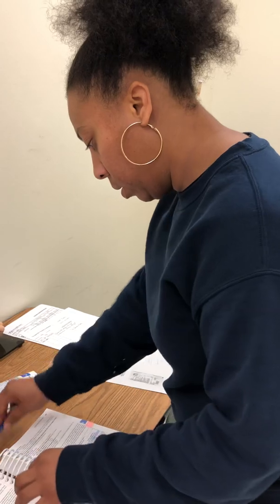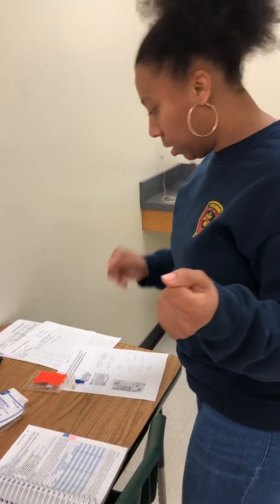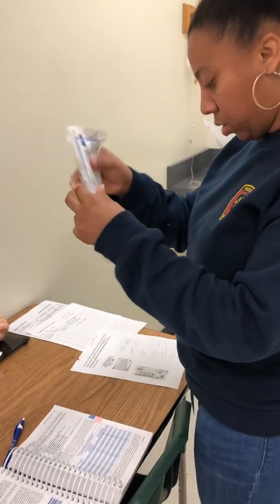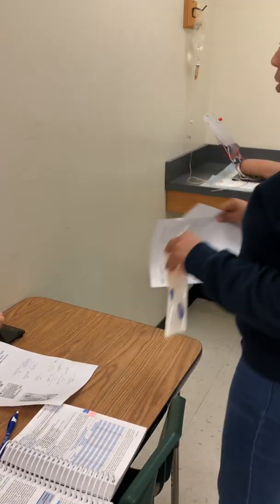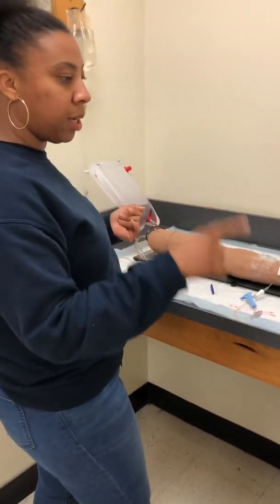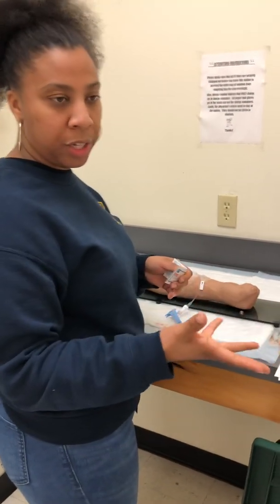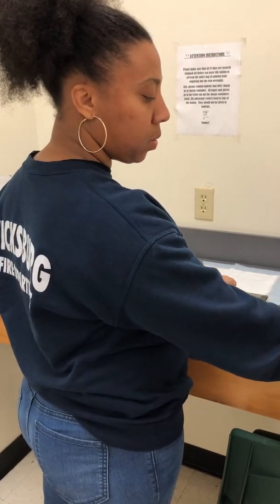So I'm going to get all of my materials together. Got my medication, got my drop set, I got my MARA, and I got my physician order. So I'm going to go over here to the patient. Have everything set here. I need to make sure I got everything I need. Like I said, I got the drop set, my medication, tubing. If I needed a syringe or whatever, I'm gonna make sure I have that, and make sure I have enough of my antiseptic wipes.